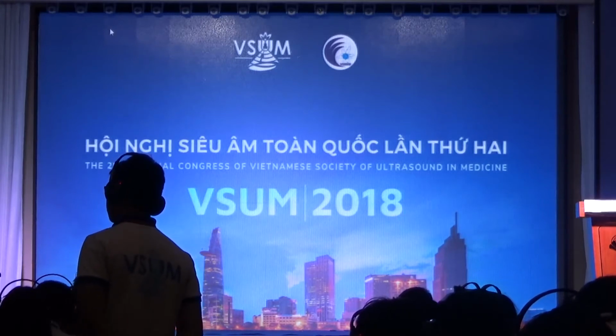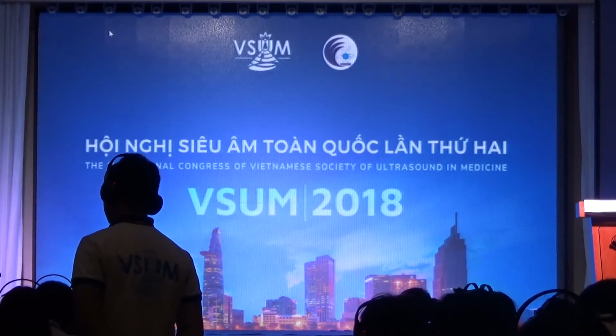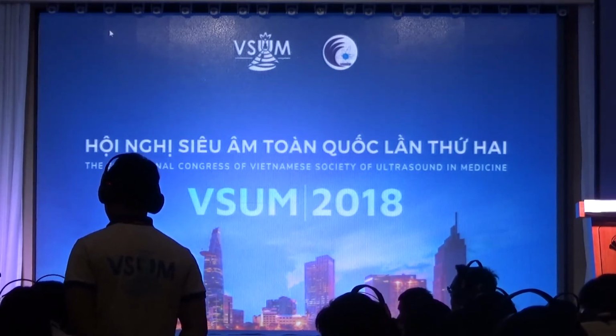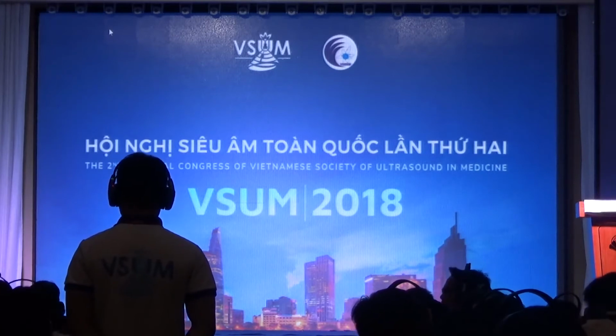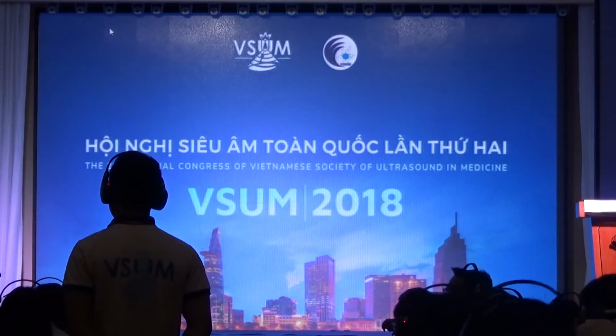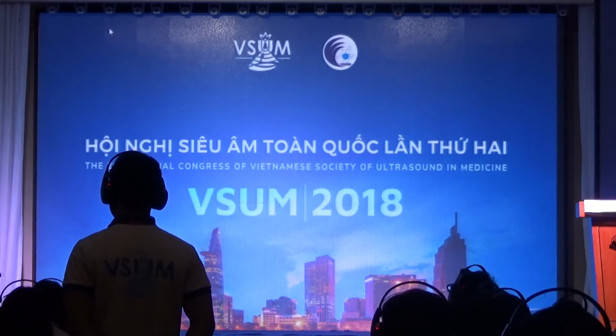Just to add the point of view of a hepatologist. If you have no fibrosis, good to know. If you have liver cirrhosis, good to know. If you have F2 or a little less or a little more, it's heterogeneous. I'm not even interested. It's intermediate. Here a little bit more, here a little bit less. In the liver, here is hypertrophy, in the caudate lobe. So it's intermediate.